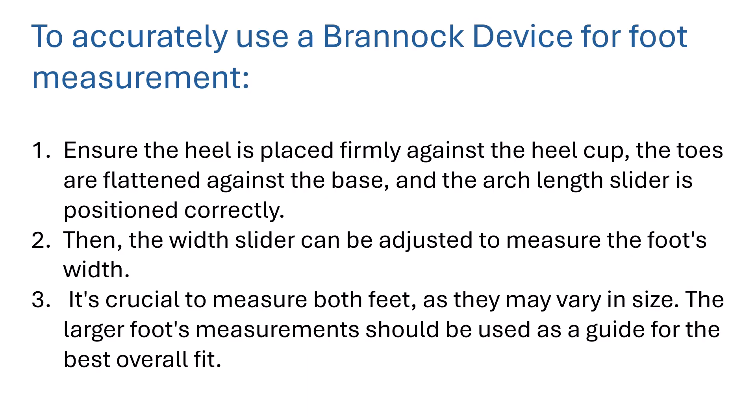To accurately use a Brannock device for foot measurement, ensure the heel is placed firmly against the heel cup, the toes are flattened against the base, and the arch length slider is positioned correctly. Then the width slider can be adjusted to measure the foot's width.